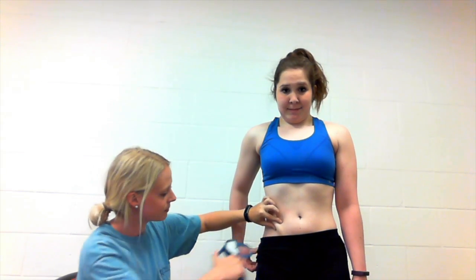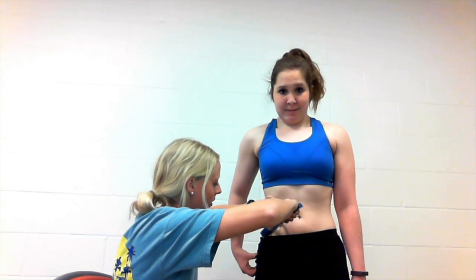I get a value of 28 millimeters for the tricep. Next is the super iliac, just above the hip bone, and I get a value of 18. Lastly is the thigh. If you have an athlete like Holly who is a dancer, it might be harder because of the muscle mass, so you can ask the individual to rise on their toes and flex their calf to give you a little more leeway. I got 29 for the thigh.